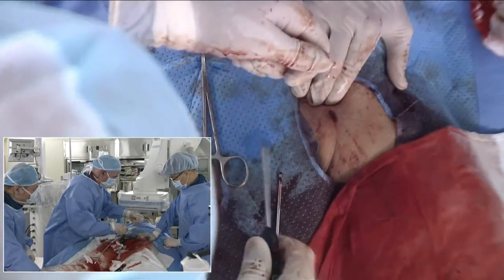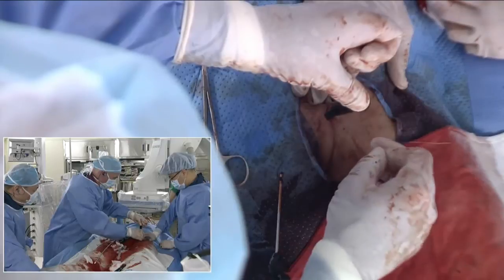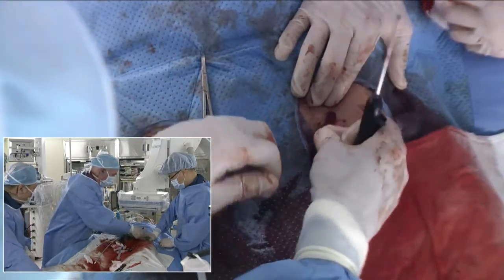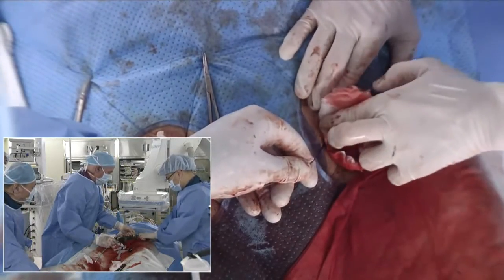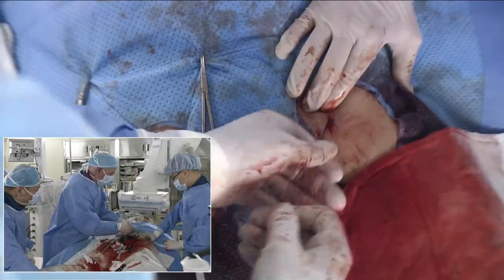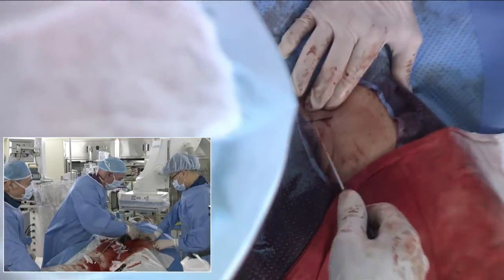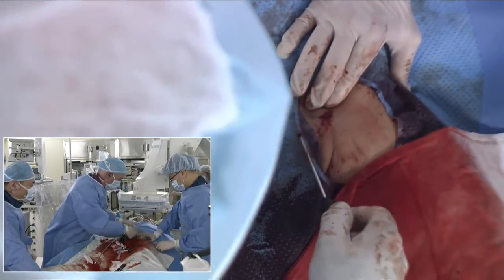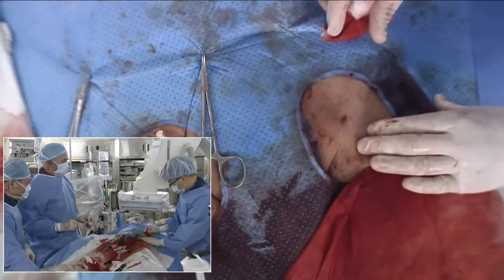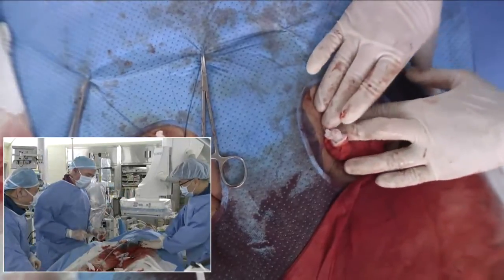So then we'll go ahead and I think get ready to lock our knots. Let up for a sec. Okay. Yeah, it's not perfect, but I think it'll be okay with a little bit of pressure. Very close. See that? So just a tiny ooze. Yeah, so that'll just be a few minutes of holding.